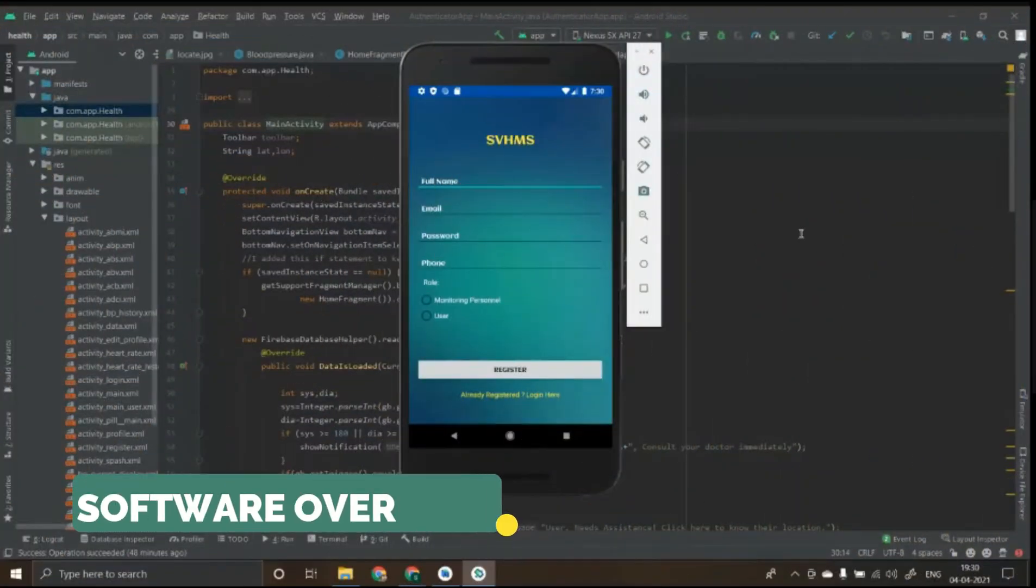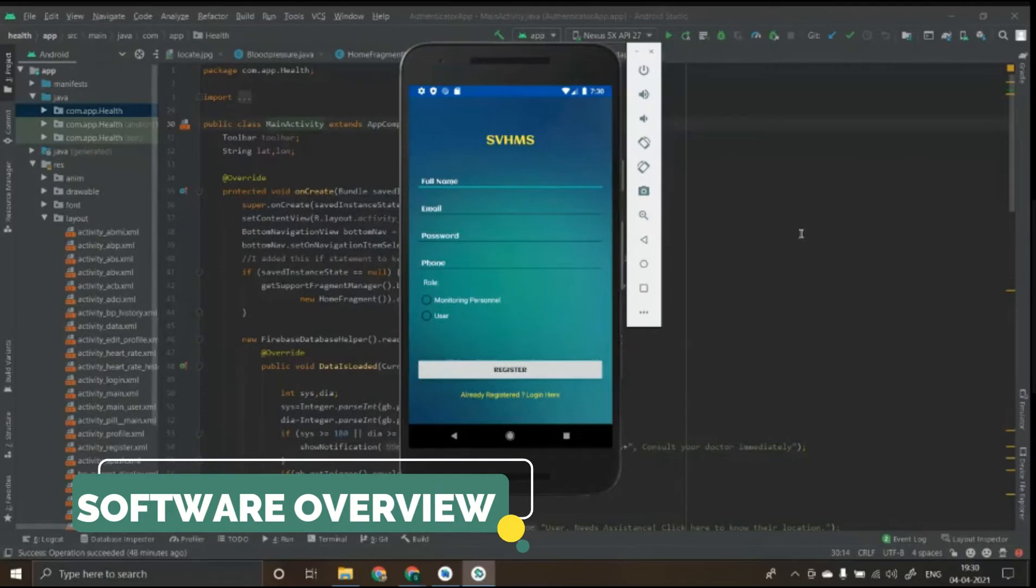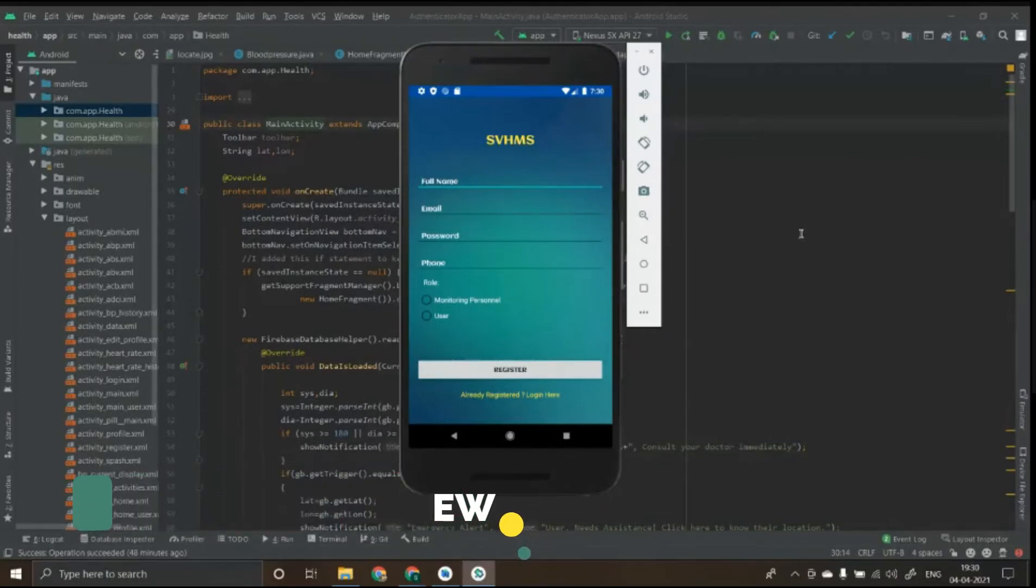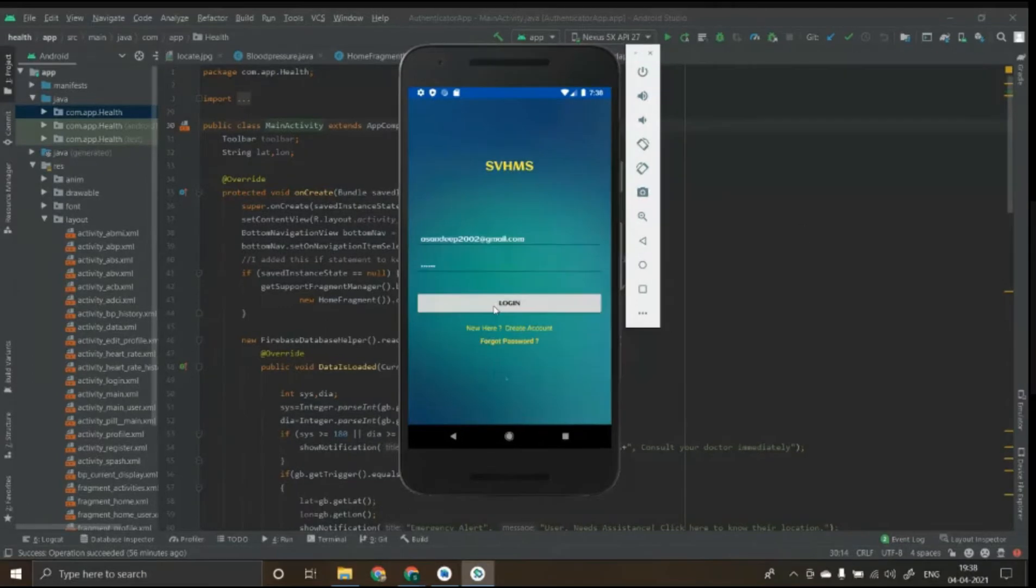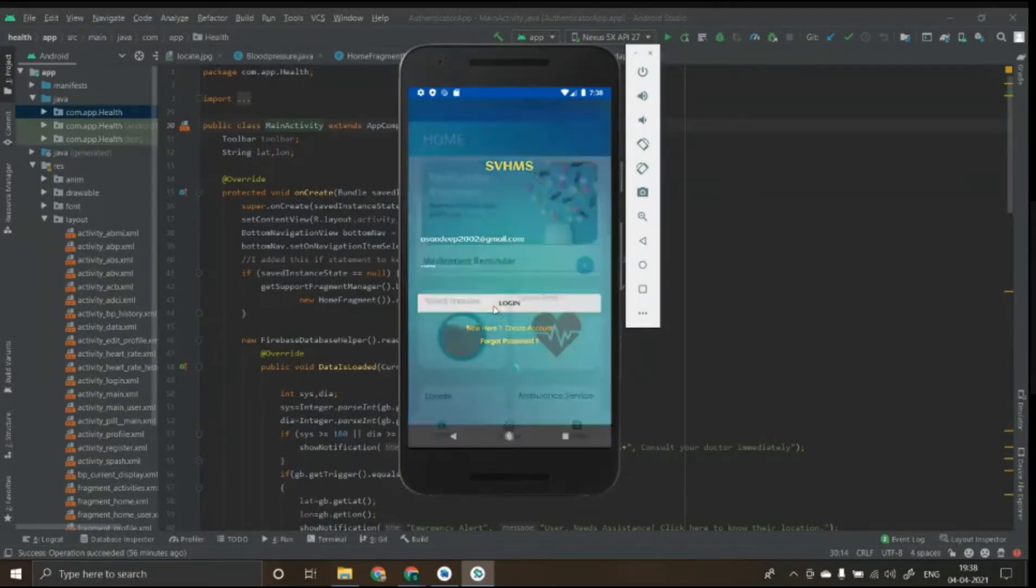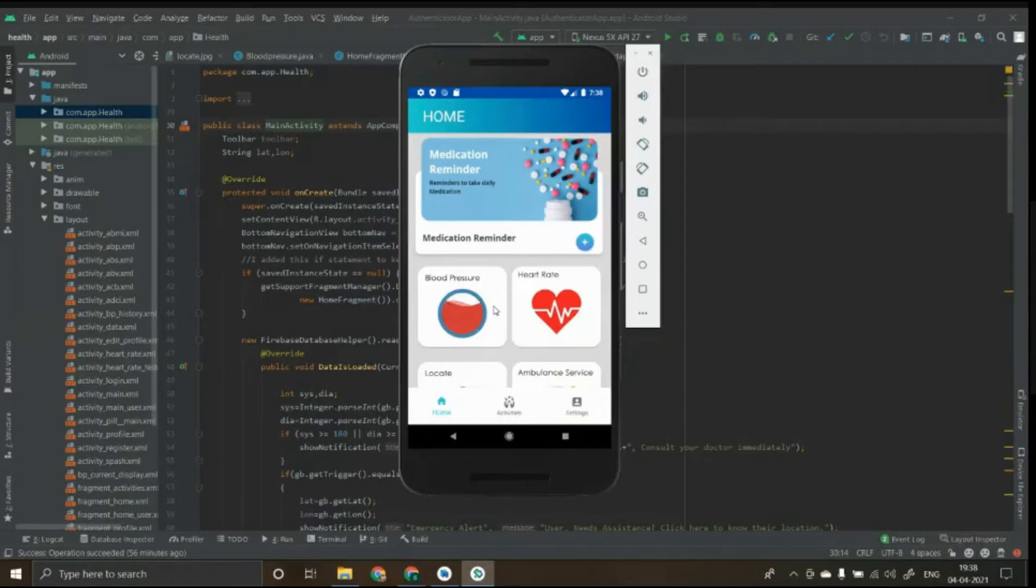This is the application interface with a register option separate for monitoring personnel and user. Monitoring personnel is for the people monitoring the patient and user are for people who wish to help out the patients on emergency event. When the monitor successfully logs in, the health parameters of the patients are visualized with other functionalities.